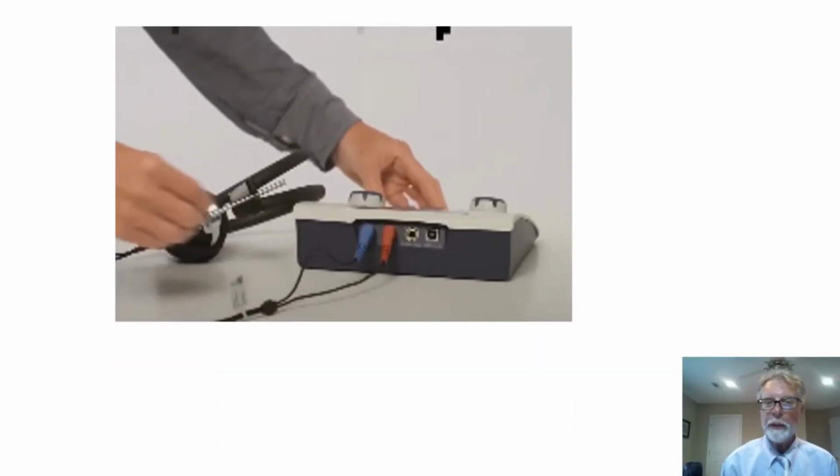Before we get started, we'll have to plug in the headphones, and this is what the back of a basic audiometer will look like. You'll have a place to plug in the left and right headphone on that headset. Two plugs, typically. And one will be blue and one will be red. Red is right, blue is left. So if they're marked left and right, you know that the blue one's in the left, red one's in the right. Sometimes they're color-coded, red and blue.